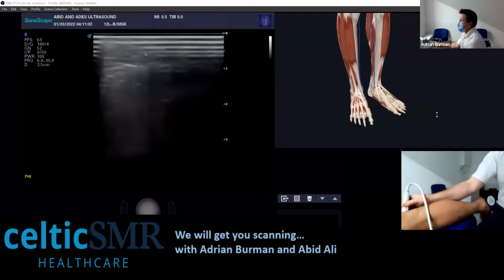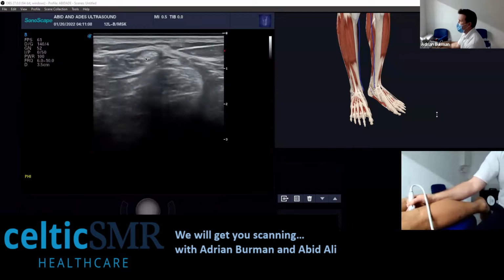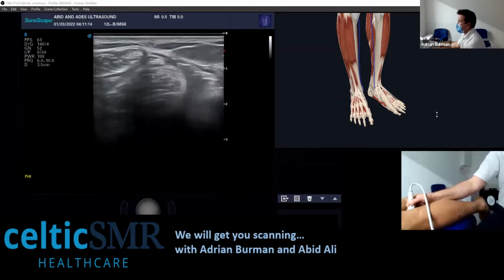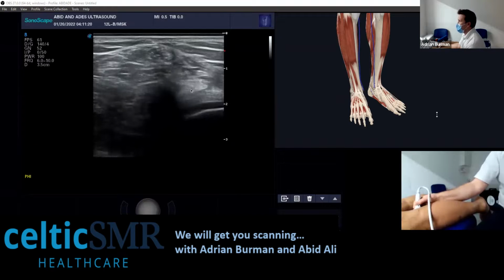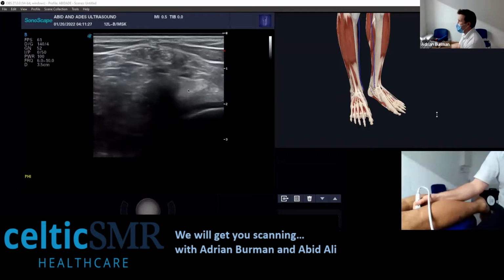Okay, so when I've got that, I follow this down, and you'll see that semimembranosus now is decreasing in size. So it's a big muscle here, and it's decreasing in size. This is semitendinosus, and it comes to a tendon here. So this is the semimembranosus tendon. There's your semitendinosus, that's your cherry. This is your semimembranosus.